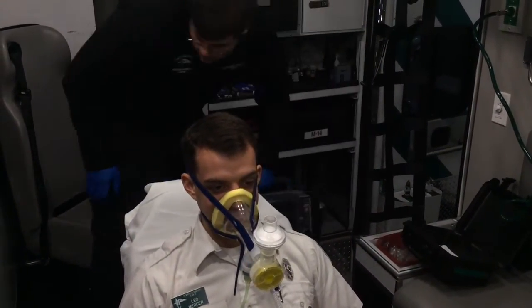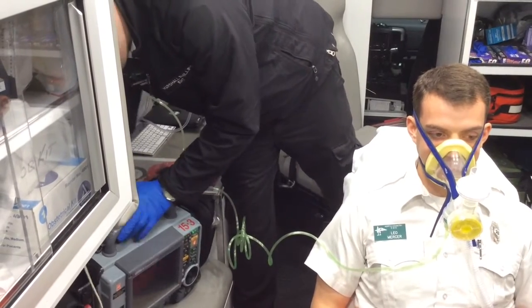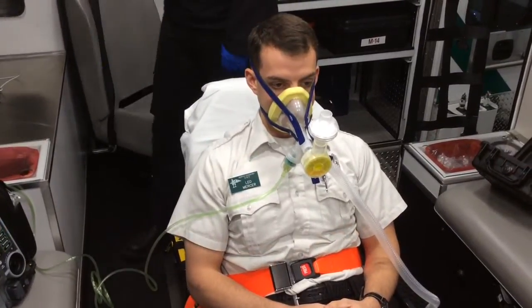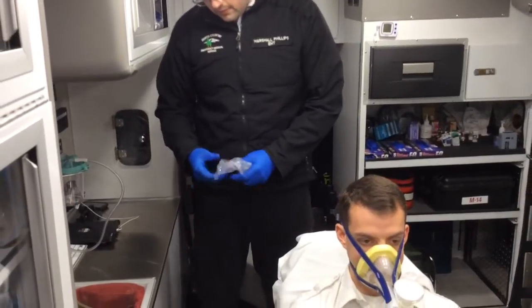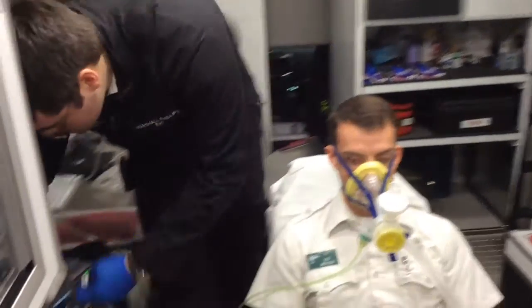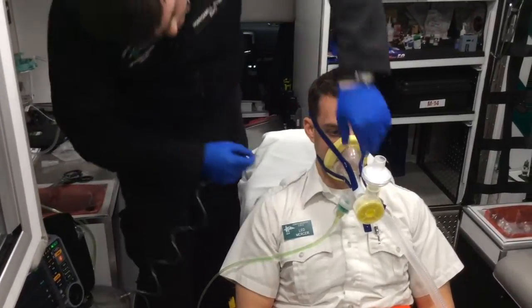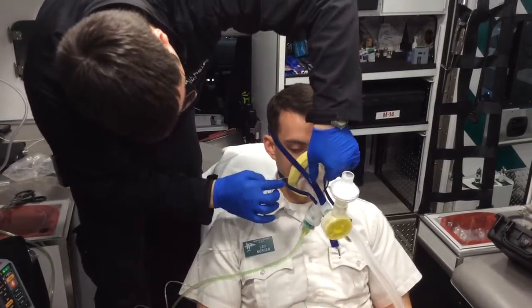At this point, it is important to put the patient on the monitor. We watch the saturation. We also need to apply end-tidal CO2 for all respiratory patients in respiratory distress — those are located up here. This is an inline EtCO2 device. We plug it into the monitor, cut off the head with regular trauma shears, and slip it underneath the mask. At this point, we need to verify there are no leaks in the mask from the hose or around the eyes.